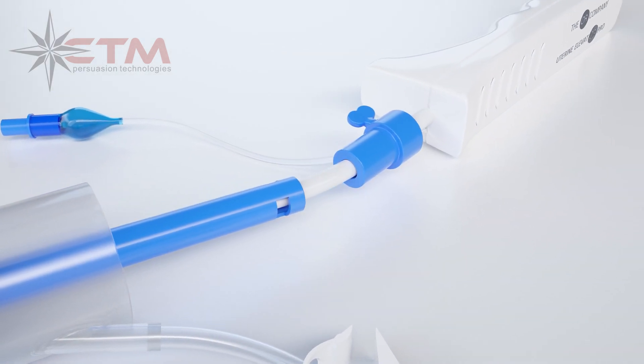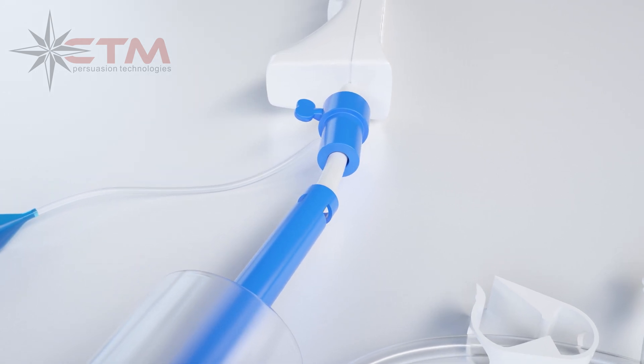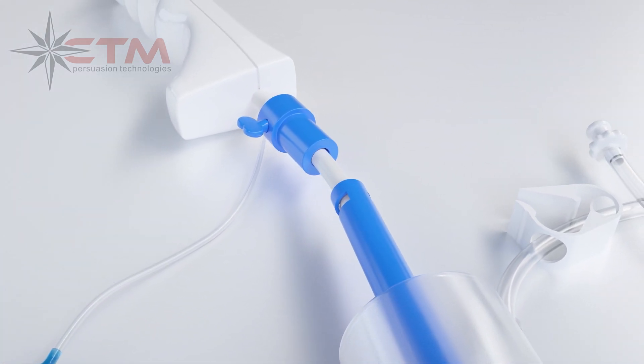A stiffer curved shaft providing optimal and superior control, and an easily adjustable seal screw that cannot be over-tightened and is engineered to be impossible to strip.